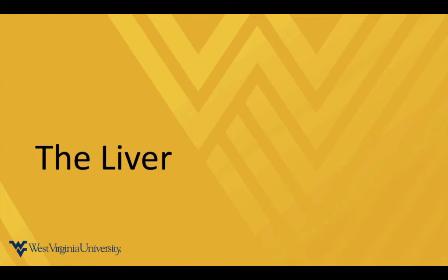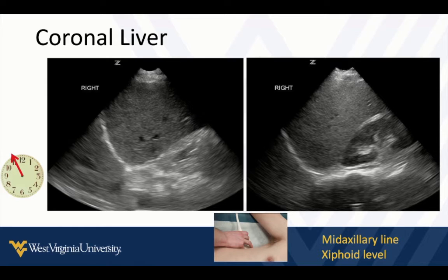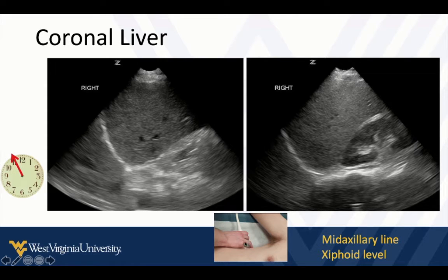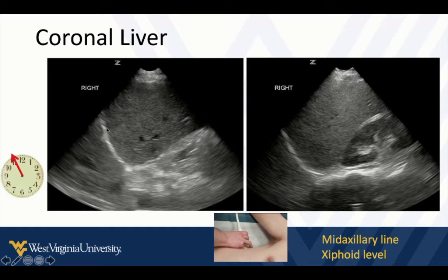On the right side, up around the liver — just recognizing what the liver looks like. If we take a view, this is how we would first initially examine the patient if we're looking for intra-abdominal fluid: starting up in the right upper quadrant in about the mid-axillary line, indicator at about 11 o'clock, and we can fan from ceiling to floor to look for the coronal views of the liver.